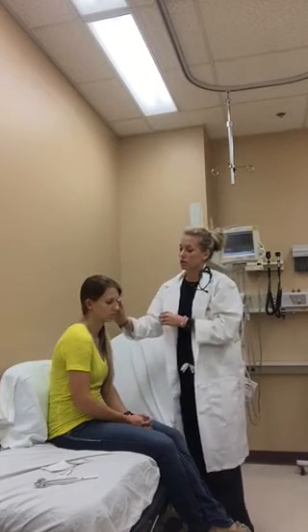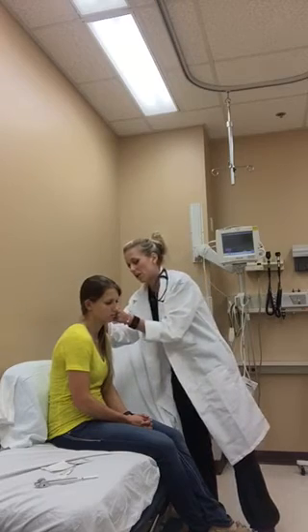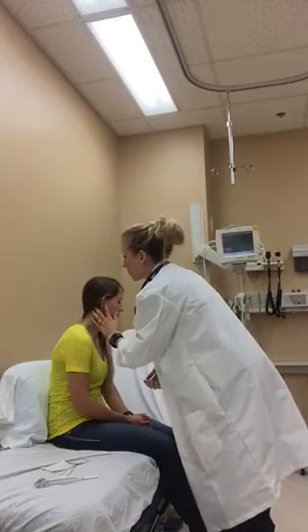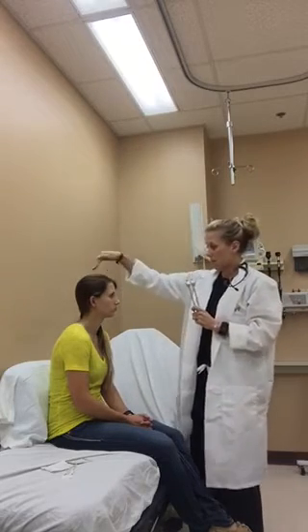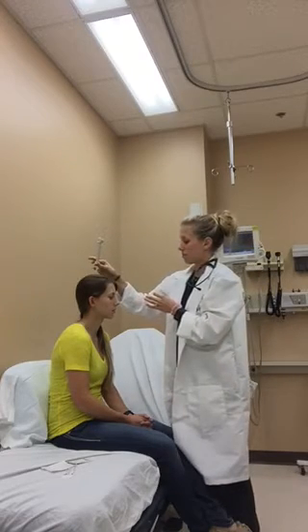So I'm going to occlude your ear, and I want you to repeat what I whisper. Baseball. And this one? Basketball. Great, so she performed that as well. At this time we'll do the Weber test. I'm going to put it right in your head, and I want you to tell me if you can hear it on both sides, okay? Okay. I can hear it on both sides. Great, so that's passed.